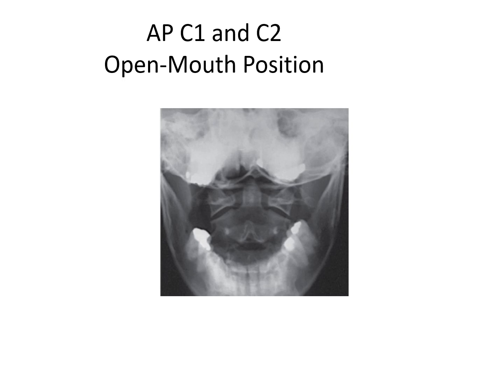This is an incredibly difficult shot. Those two objects that are superimposed, the base of the skull and the front teeth, are typically 8 inches apart. This tech got them right on top of each other. We're not even 1 degree out of rotation here. This is perfectly positioned.